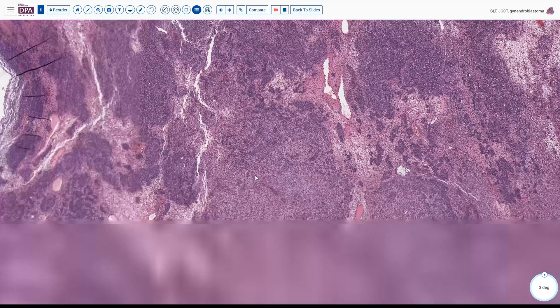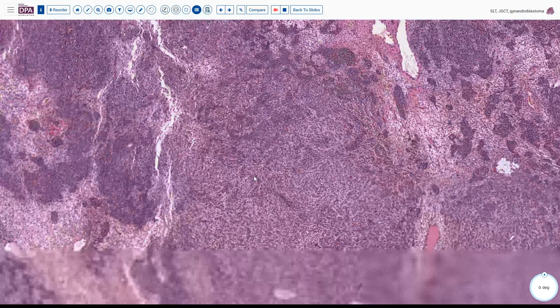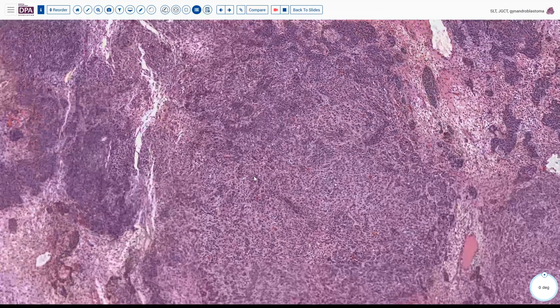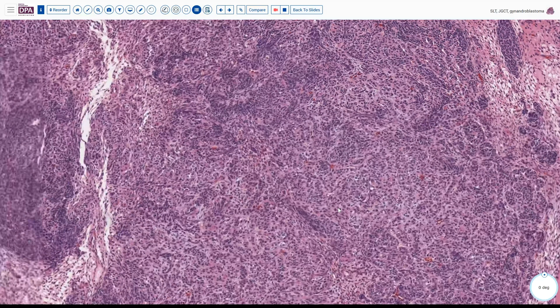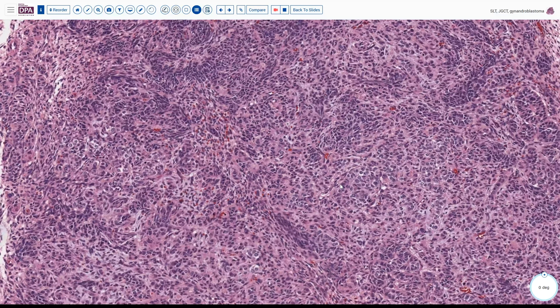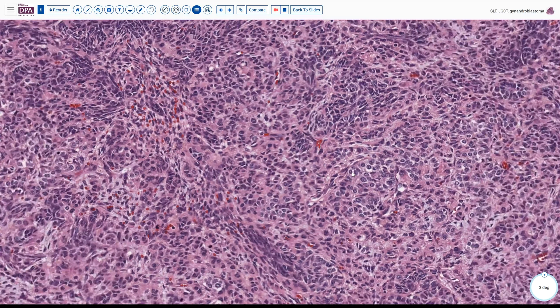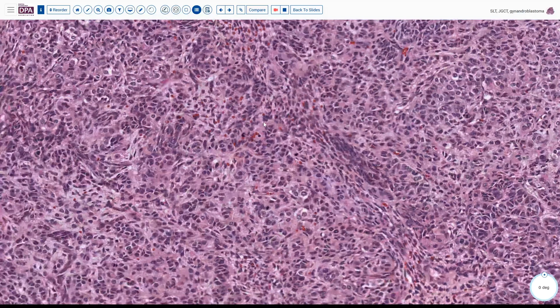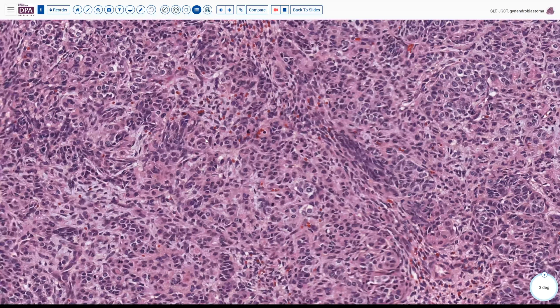As we look at this tumor, we see other areas with a more open appearance to some of the tubular structures, a little bit more pale cytoplasm, and a more epithelioid appearance to some of these nests or tubules. We also see some more nesting and a little bit of a cording type of pattern.